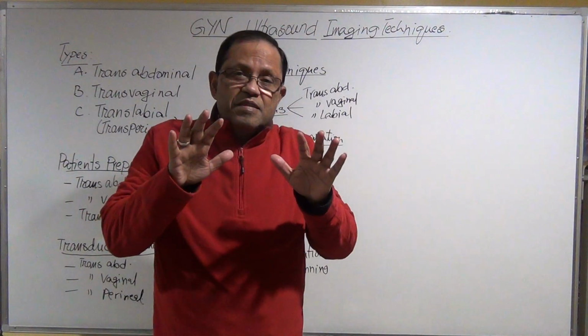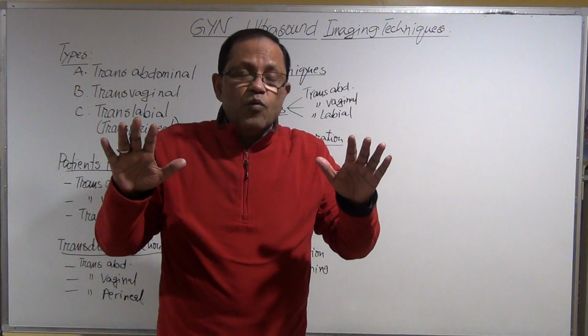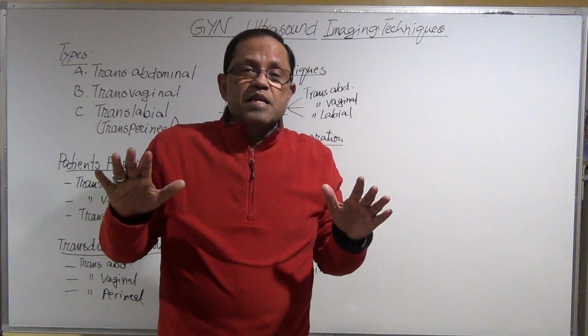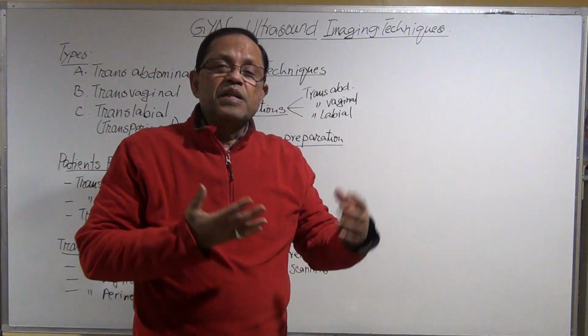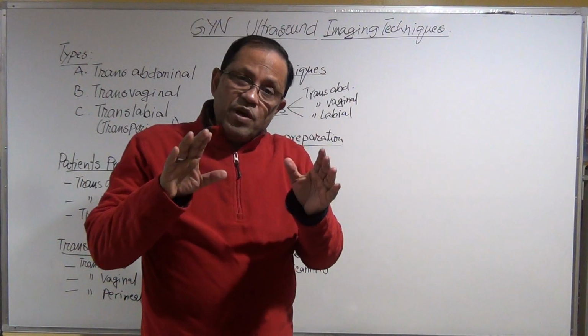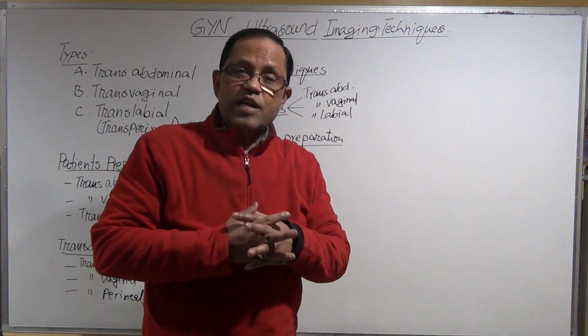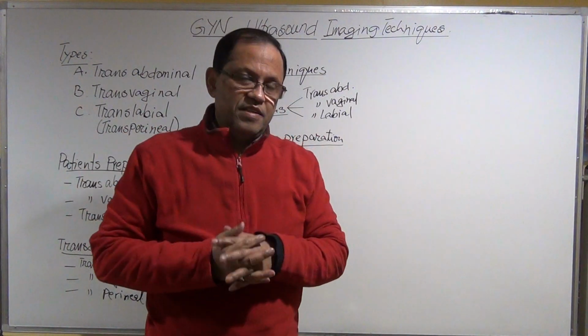There are at least 3 different ways you can evaluate the female pelvic organs, the female reproductive organs, and not everybody will have all those 3 types, and their indications are also different.